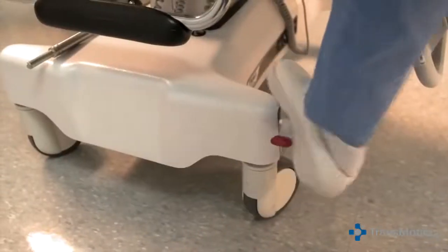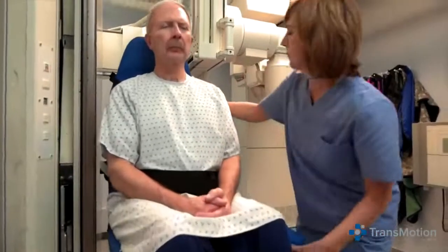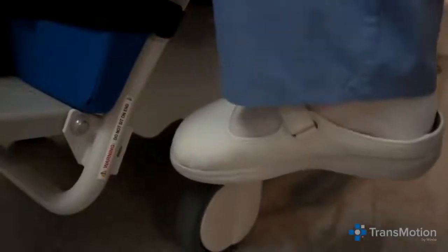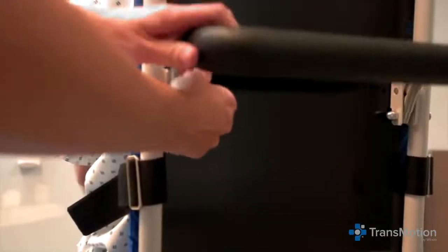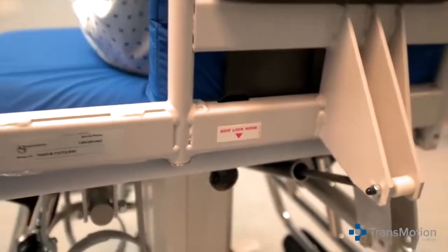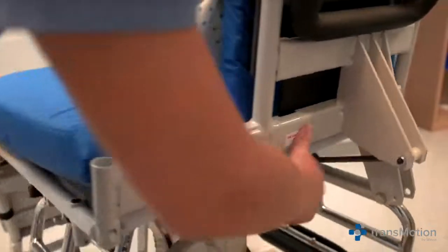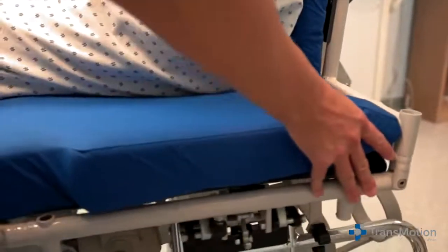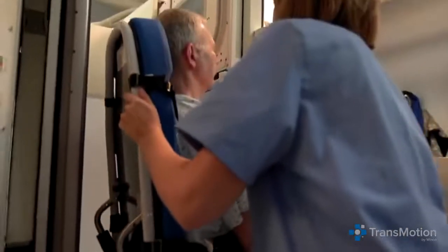For the AP view, unlock the brakes and roll the patient from the RF tower, then lock the brakes. Raise the chair to its maximum height. Release and lower the push bar. Next, pull the seat lock knob located at the back of the chair and rotate the chair counterclockwise until it locks into place. Unlock the brakes and roll the chair into the RF tower. Now you're ready for the AP view.